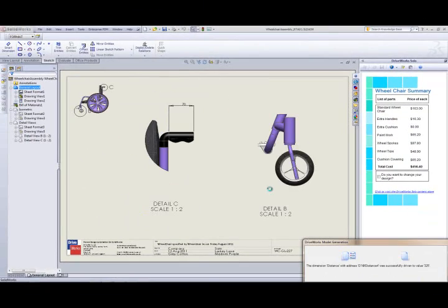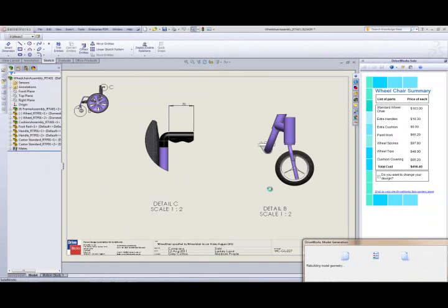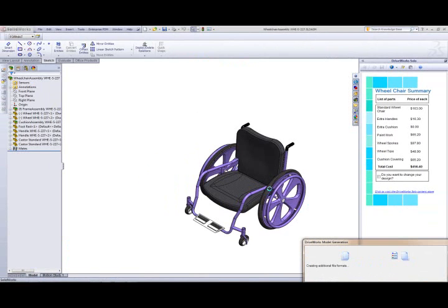As DriveWorks Solo generates the files, you can see that the model geometry is rebuilt based on the requirements that we have entered. The model is then saved to the location that we have specified in the rules when we set up the project.